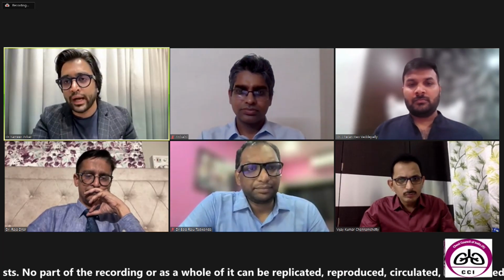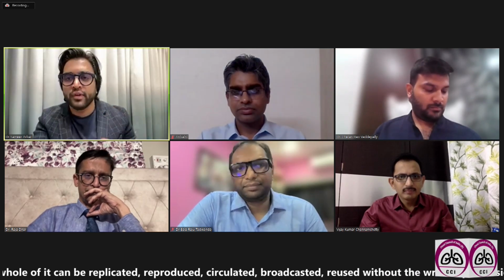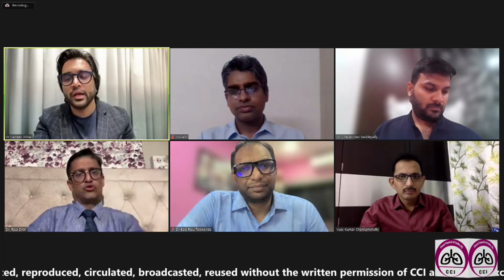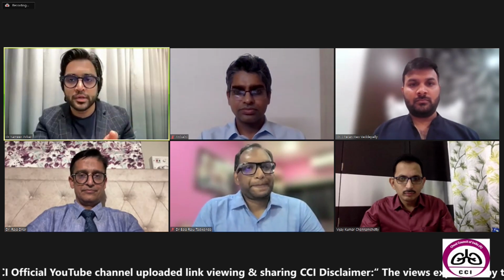And as you had asked me, I would say that there is no unit which can be only a standalone cryo unit. For every case that I'm performing cryobiopsy, I have the electrocautery unit ready as a standby. And for half the cases, they work in tandem. So a patient has an endobronchial tumor. The first approach is with either the electrocautery snare or the blunt probe or the knife, then followed by cryo for extraction. So I would not suggest that anybody should start a cryo unit without a rigid bronchoscopy unit and a hot therapy, which can be either an electrocautery, an APC, or a laser.